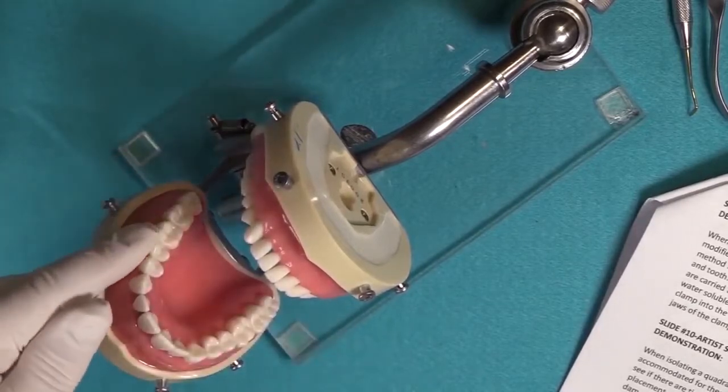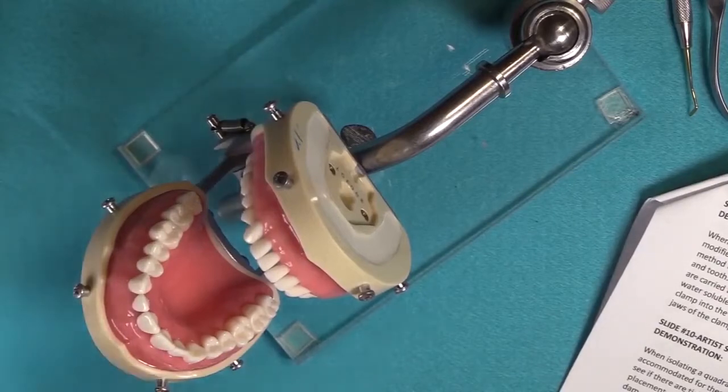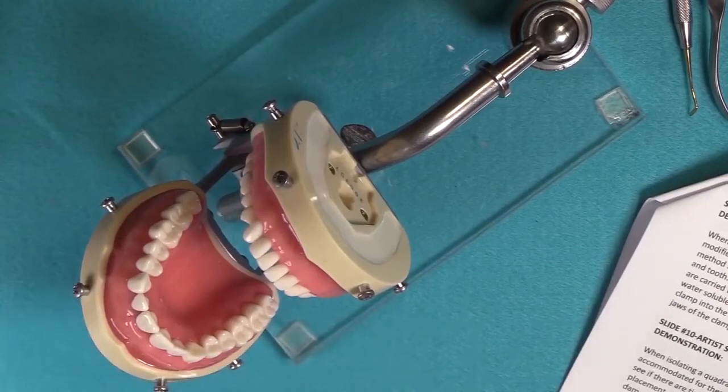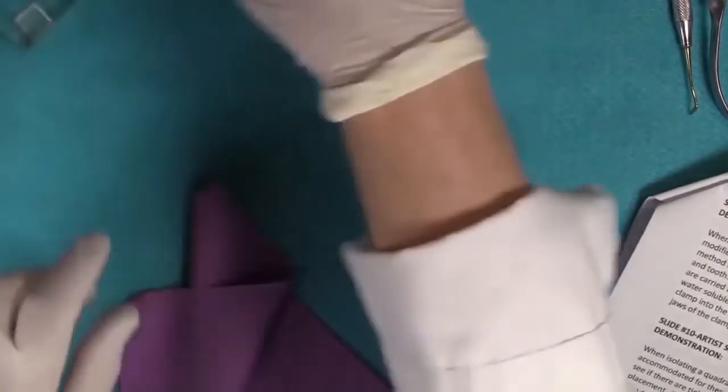I'm checking to see if there are any malposed teeth, any missing teeth, because I have to accommodate for those situations. But Miss Smith is pretty good, so she doesn't require anything. All right, so here we go. So I'm going to my dental dam.